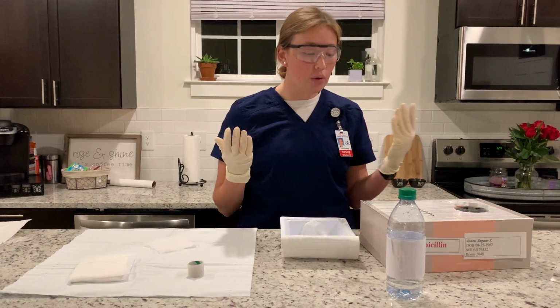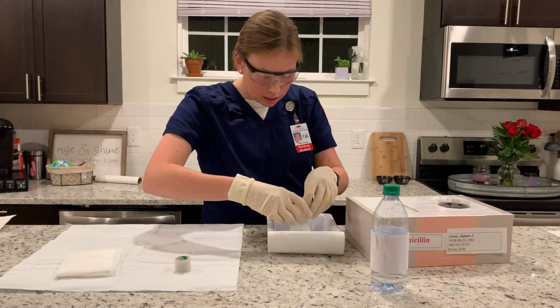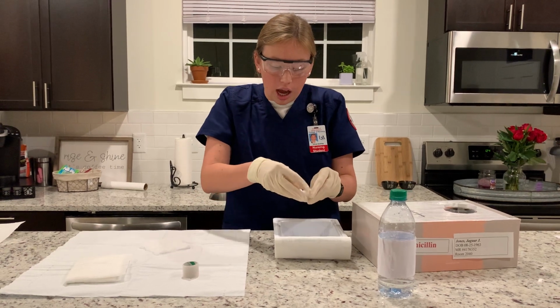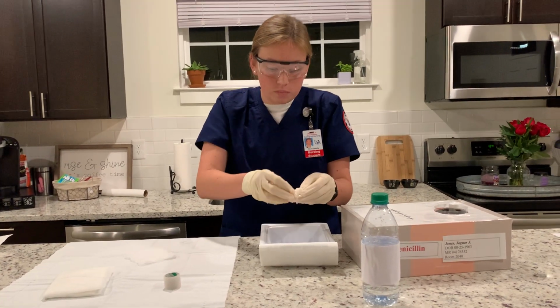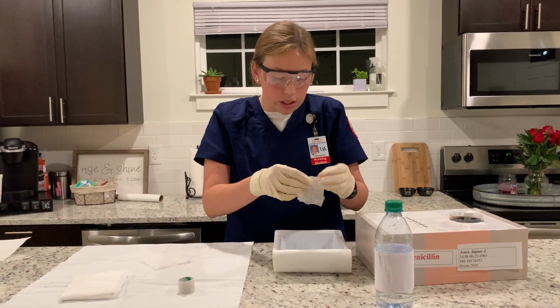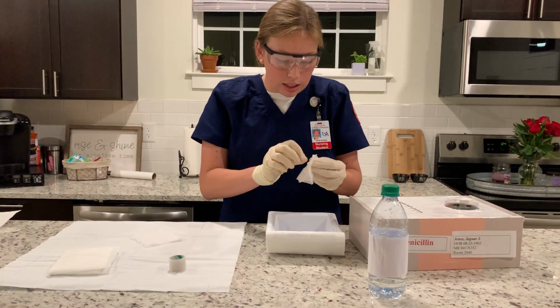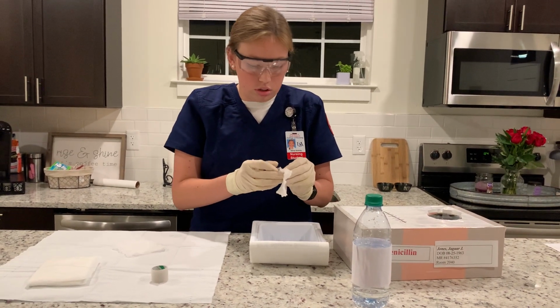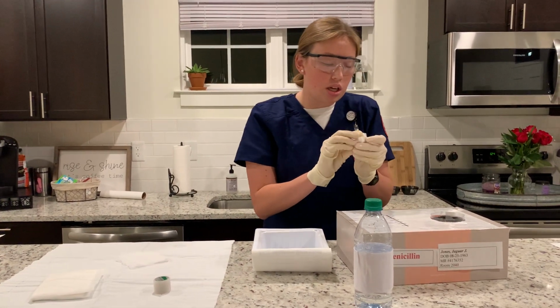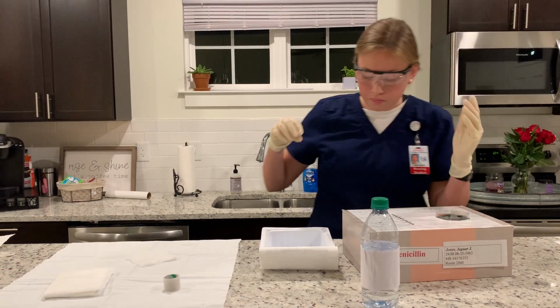Okay, now I'm going to pack the open wound. So I'm going to take some of the 4x4s in the saline solution. I'm going to squeeze out any of the excess fluid, and then I'm going to open this 4x4 up really well to fluff it. We do this so it'll fit loosely in the wound. Okay, and then so I'm just going to put it in the wound without touching anywhere around the wound edge.